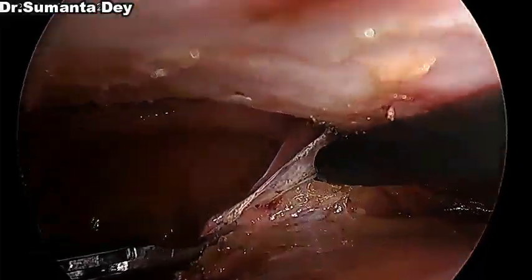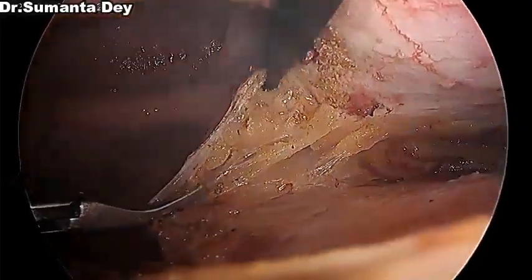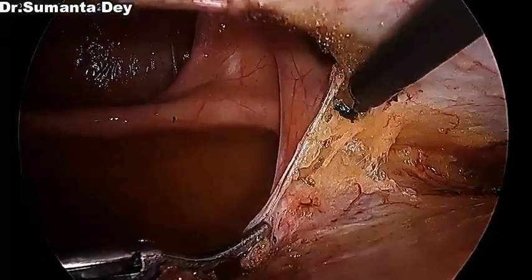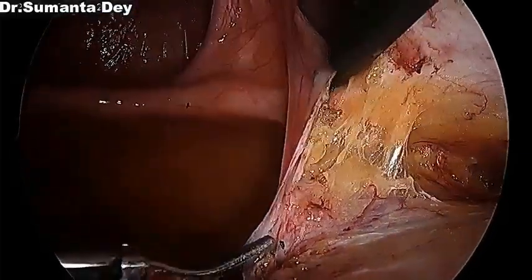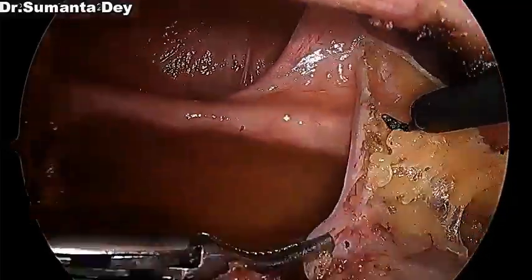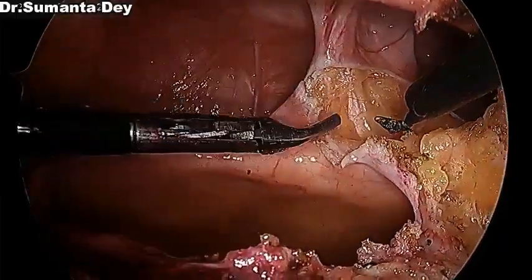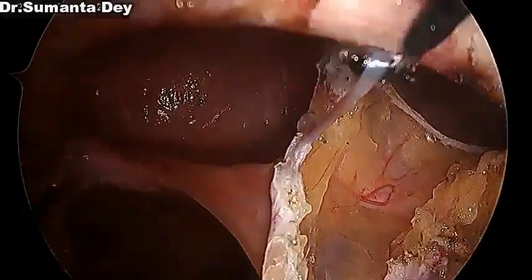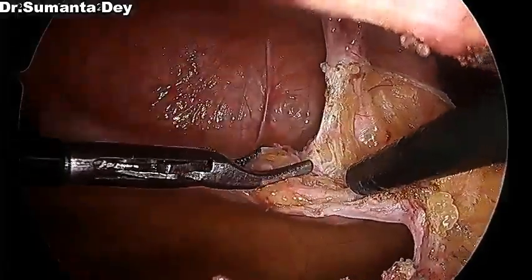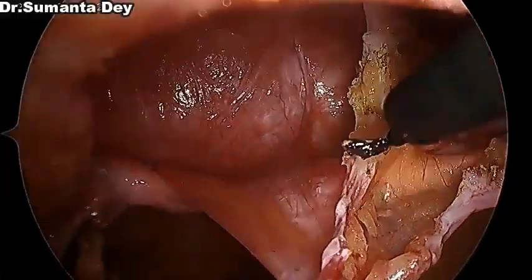So here also, while dividing the peritoneum, I am giving a good amount of traction with my left hand instrument, so that I can bring some amount of peritoneum which is actually inside the hernial cavity, so that I can get a good amount of peritoneum into the flap side. So you can see I am now going inside the hernial cavity, from where I am trying to dissect some peritoneum off the abdominal wall, so that I can bring the peritoneum inside, and that will help me in closing the peritoneal rent.